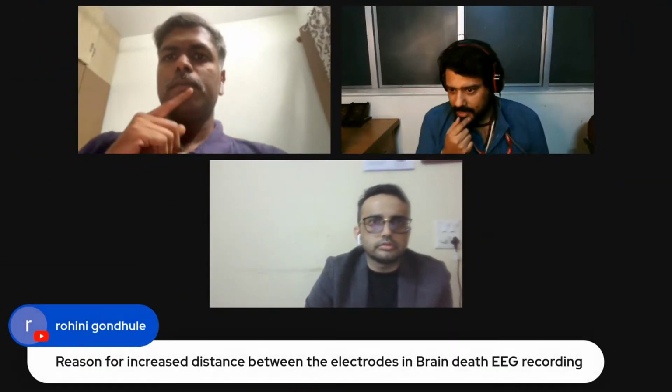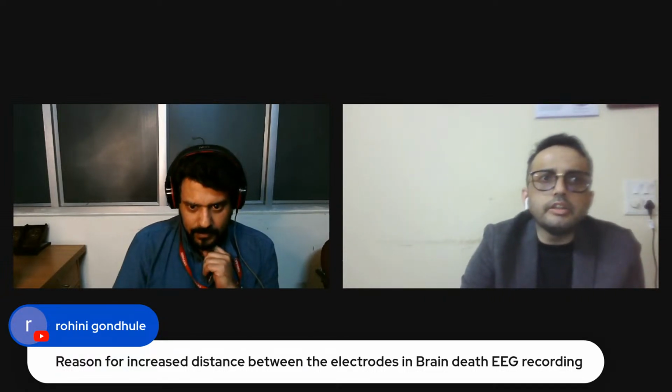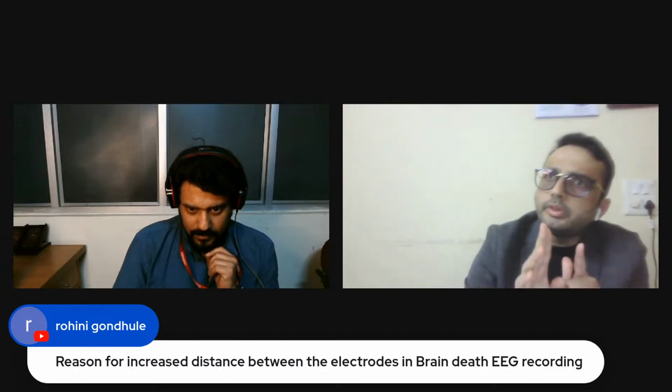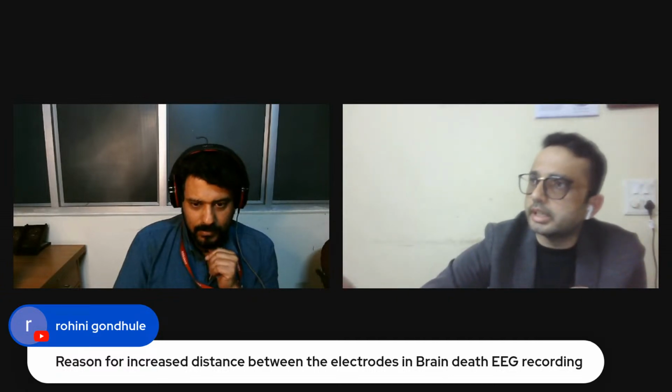Okay. Dr. Rohini is asking a question. Reason for increased distance between the electrodes in brain death EEG recording? That's a very good question. So normally, in a bipolar montage, like here I will show FP1, F3. It is showing the difference between the two channels. If both the electrodes FP1, F3, I place them very close, the amplitude difference between them will not be much. But if we increase the distance between the two electrodes, obviously the potential difference will be high. So that is why we are increasing the distance in the bipolar, like in the case of brain death, because we don't want to miss even the tiniest of the brain potential. That is the whole idea of increasing the distance.